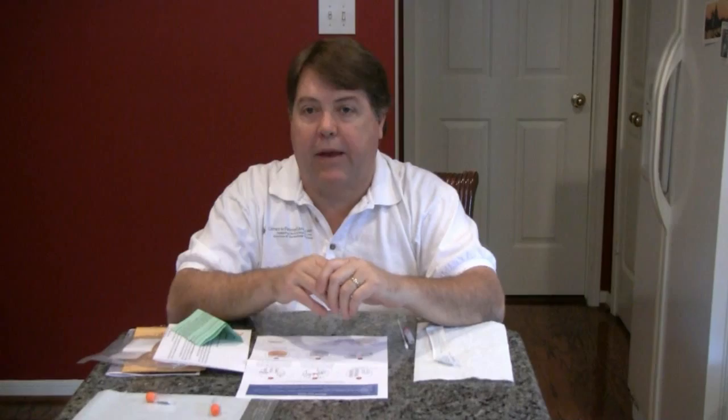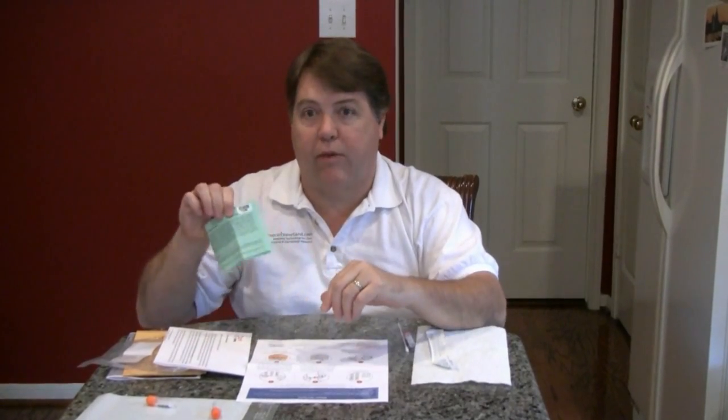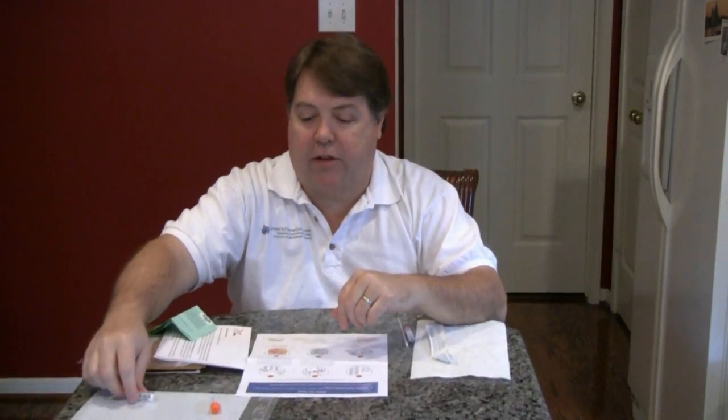A few notes before you begin. Be sure that the kit number on your release form matches what's on the vials that you're going to submit to the lab. Also try to wait at least one hour after eating or drinking before you take your swab test. That helps get the maximum amount of your DNA on the kit, which also helps the sample last and be testable for the longest period at the lab.